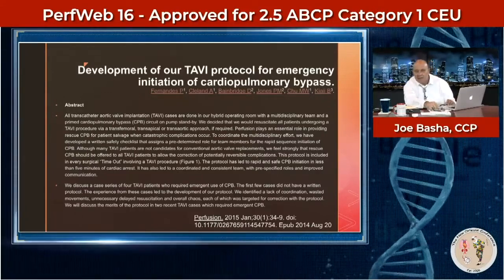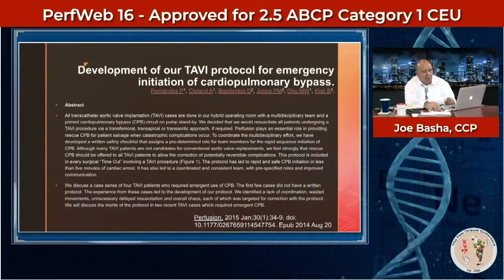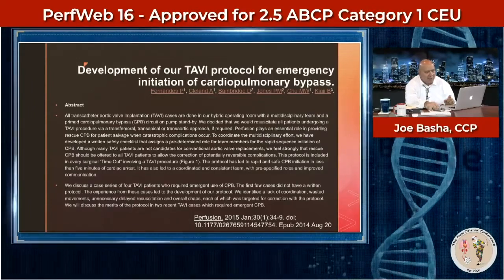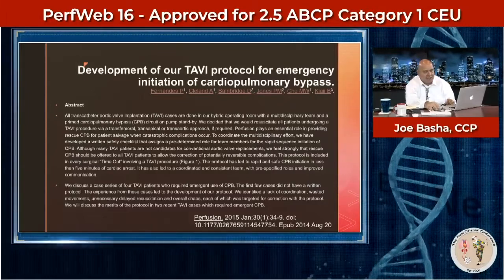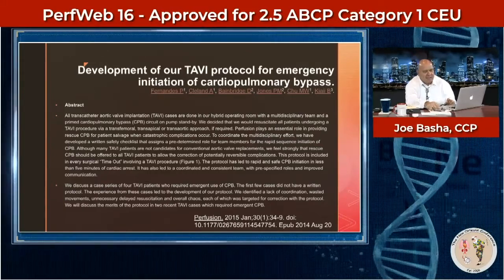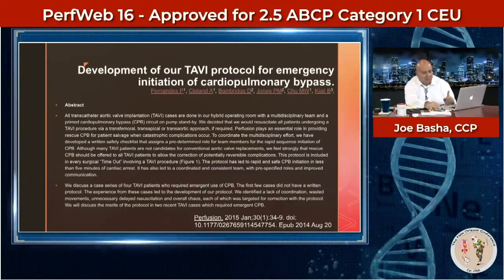Now, they might go into VFib. In fact, that happened to me today. The protocol is included in every surgical timeout involving TAVI procedures. The protocol has led to rapid and safe CPB initiation in less than 5 minutes of cardiac arrest. It has also led to a coordinated and consistent team with pre-specified roles and improved communication.